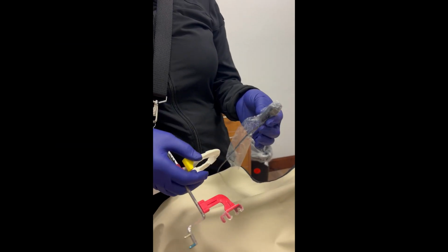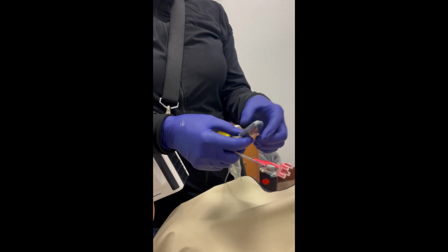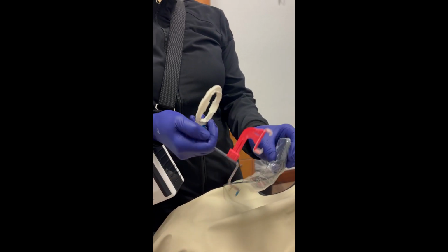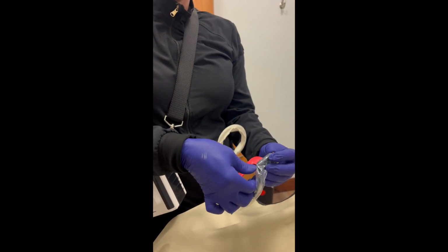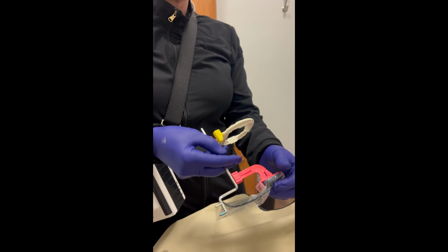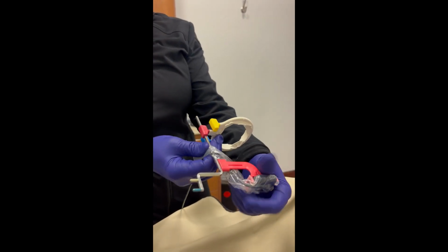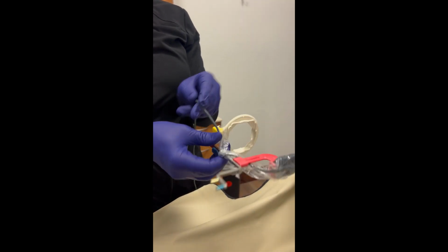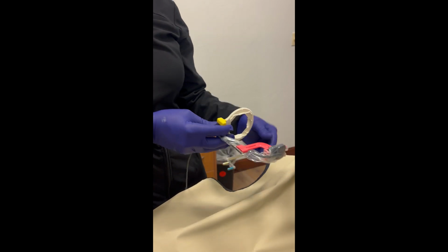Okay, I've got my digital sensor here, and we're getting ready to take our bitewings in our patient's mouth now. So I've covered my sensor so that I can stick it in their mouth. And then I place the bite tab around the sensor like this. All right, now I like to wrap my cord around the arm of the RINN device to keep it out of the way. All right, so we're going to place it in the patient's mouth now.